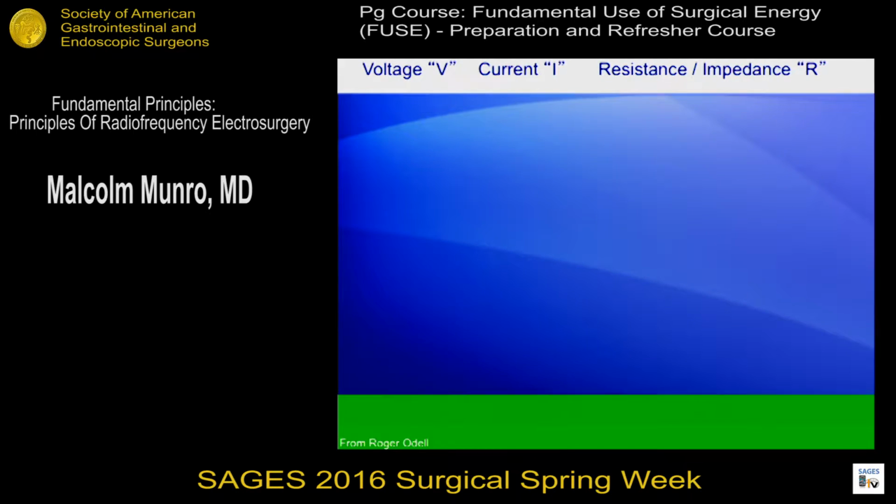First I'm going to show you a metaphor that really helps you understand part of it in the context of direct or constant polarity circuits. So this is Ohm's law, and this is really the most important equation, and it's only one of two equations I'm going to give you. That shows you that the current is directly proportional to the voltage and inversely proportional to the impedance.